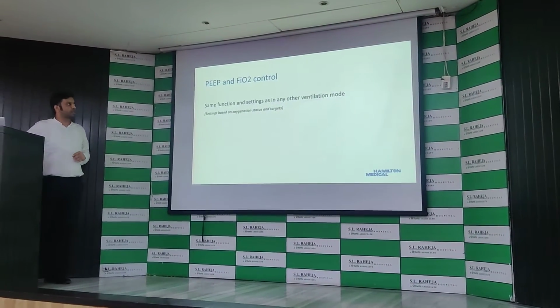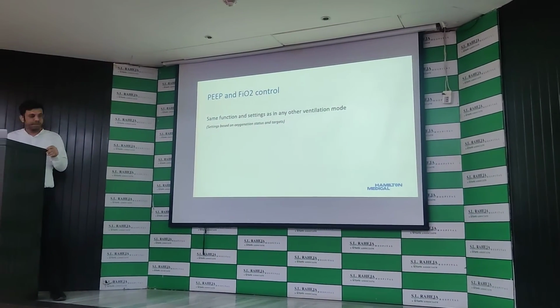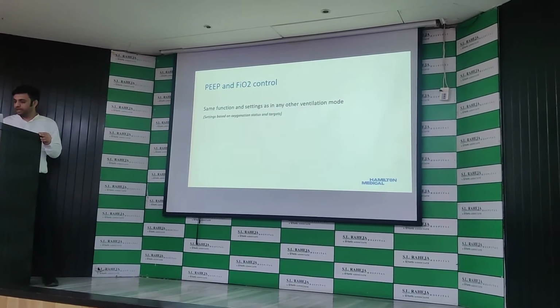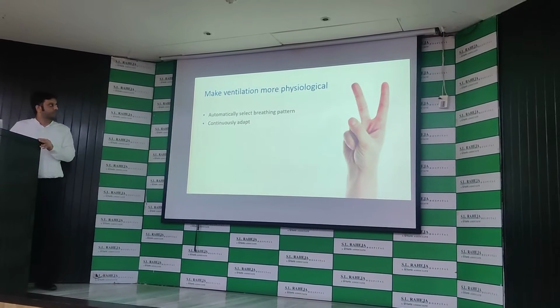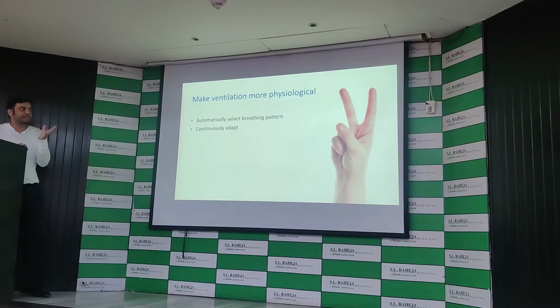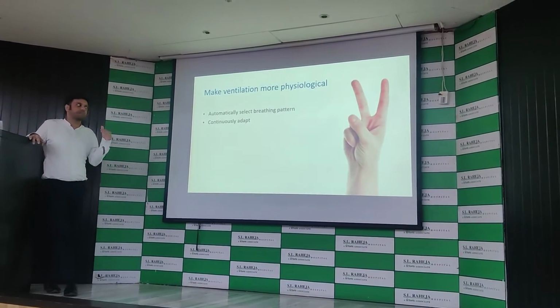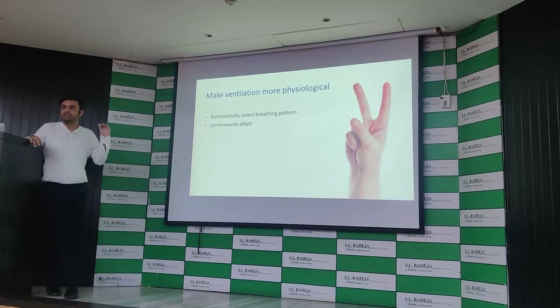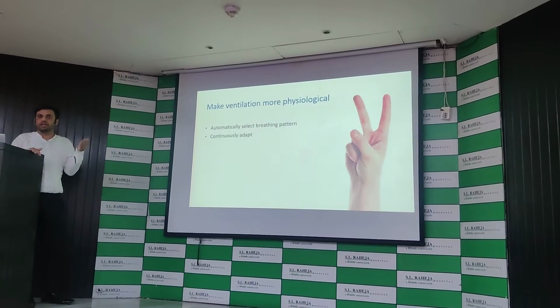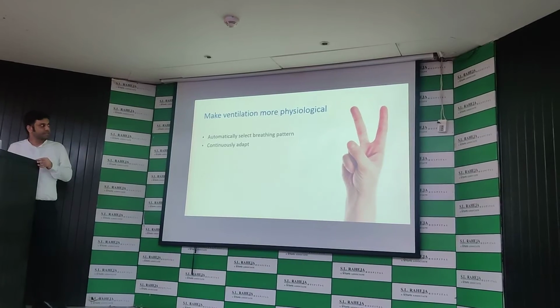Now PEEP and FiO2 control is the same function setting as in other ventilator modes, which we will have to control ourselves. It is all based on the setting of the oxygenation and the target we want to achieve. What makes it more interesting is that it automatically selects the breathing pattern and continuously keeps adapting, changing the settings as per the achieved target volume and rate.